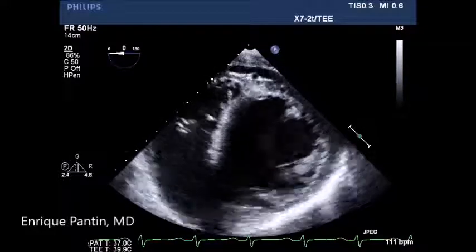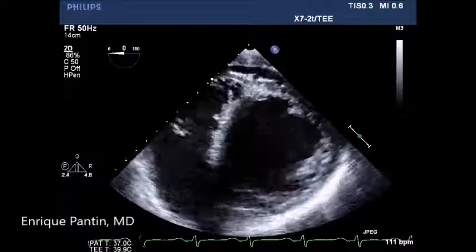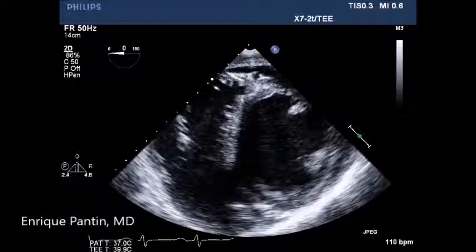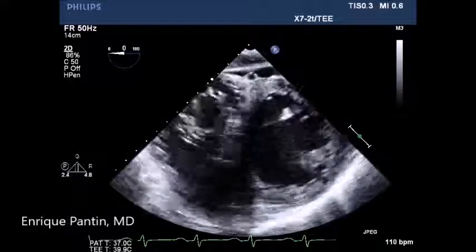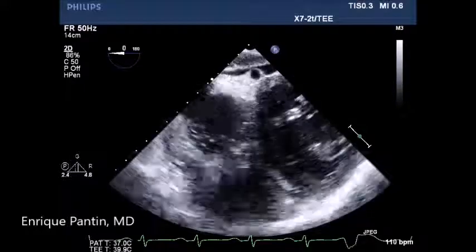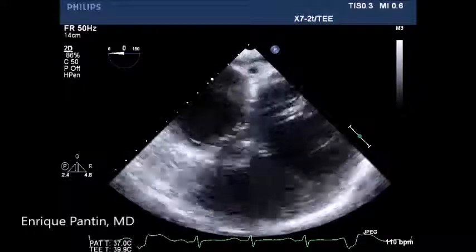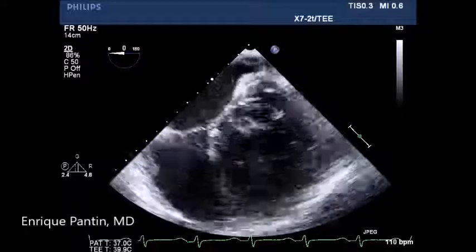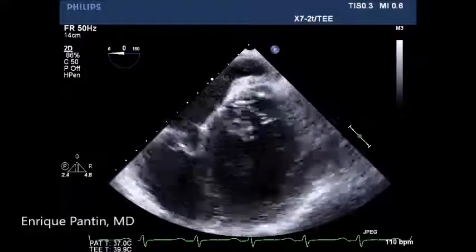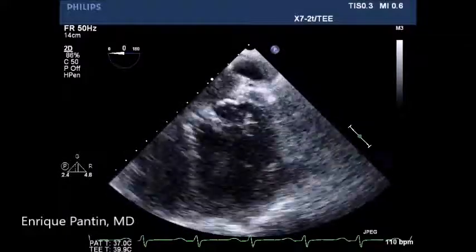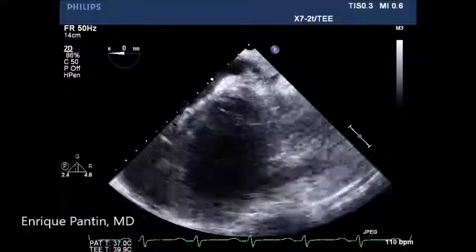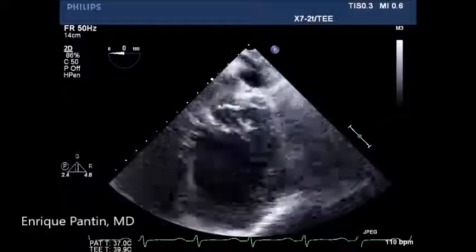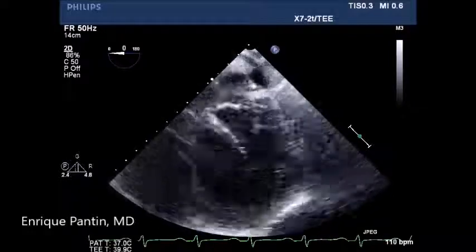Then we will pull it out and repeat the same motion to see the middle cardiac vein draining into the coronary sinus. We will turn the echo probe to the left to see the body of the coronary sinus and distal coronary sinus as it converts into the greater cardiac vein.